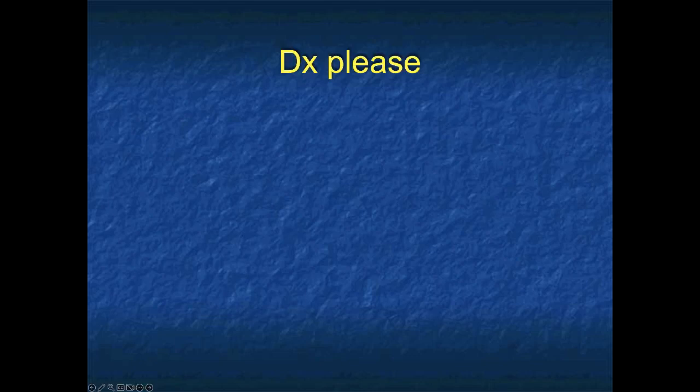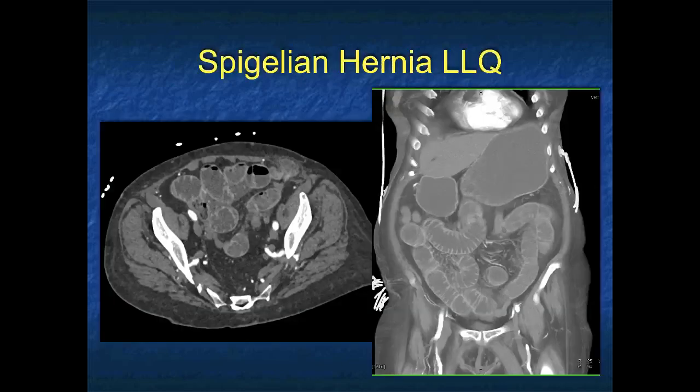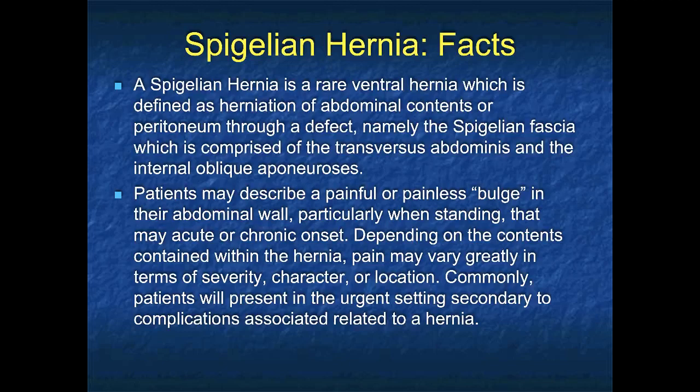What is that hernia called? Okay, it's a defect in muscle, left lower quadrant, got a bump. Spigelian hernia, just a beautiful example. Spigelian hernias need to be operated on or they'll recur or you can have complications.